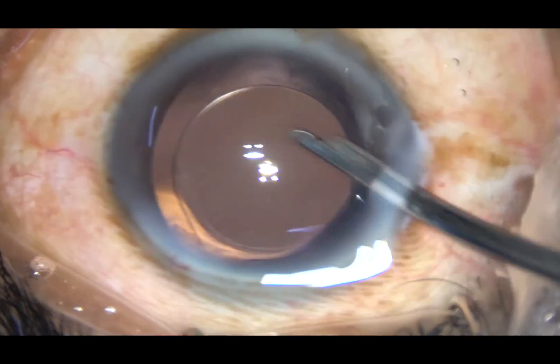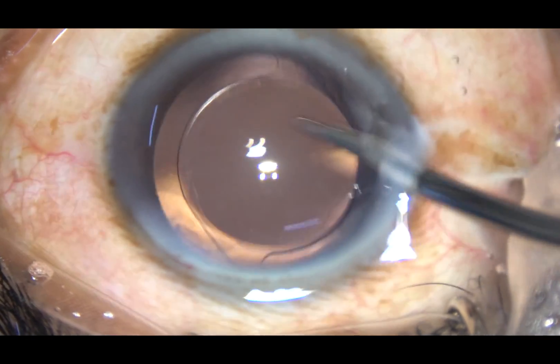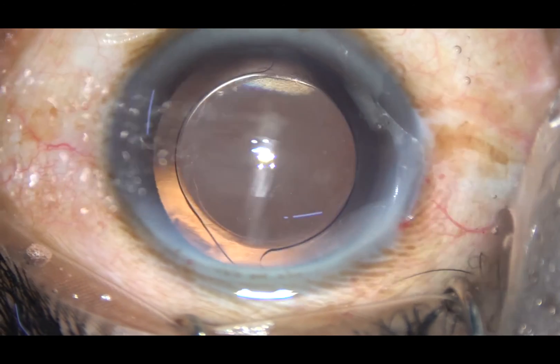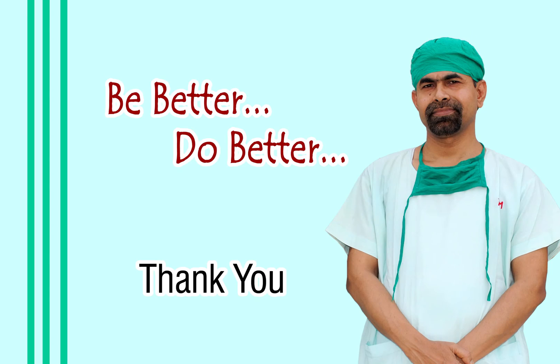The anterior chamber is formed and the case is concluded. Dear colleagues, we must develop our surgical skills every day, every month, every year. We must improve our surgical skills and give the best service that we can to humankind.